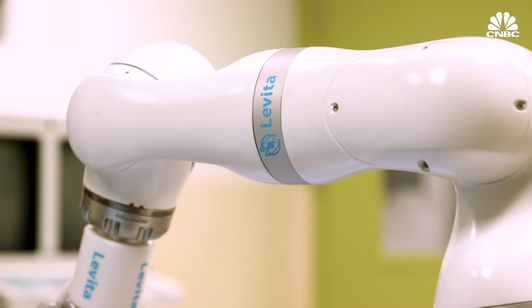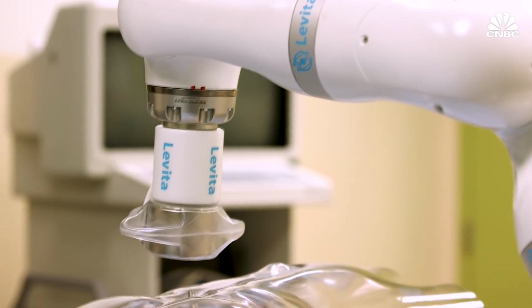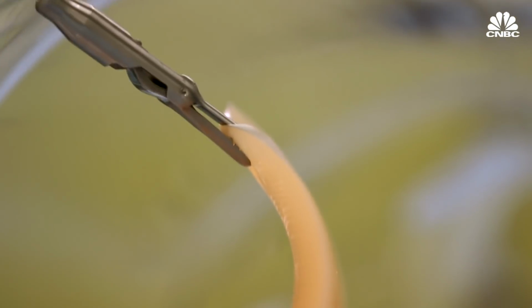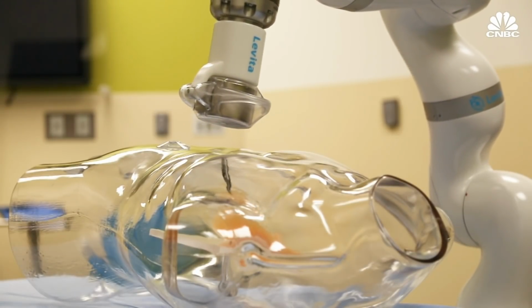The future of surgery, I'm totally convinced that will be with magnets and robots. The next phase of Levita, the magnetic arms will be robotic with precise cameras. This will allow one surgeon to perform complex procedures alone, ones that would normally require 2 surgeons. And maybe one day, introducing AI, so robots can actually perform the surgeries on their own.